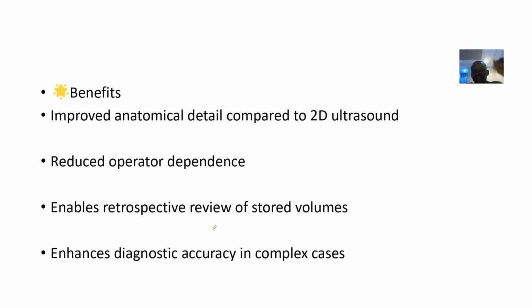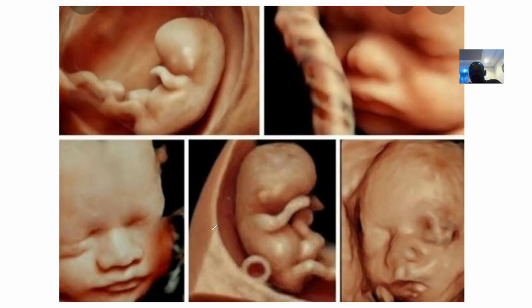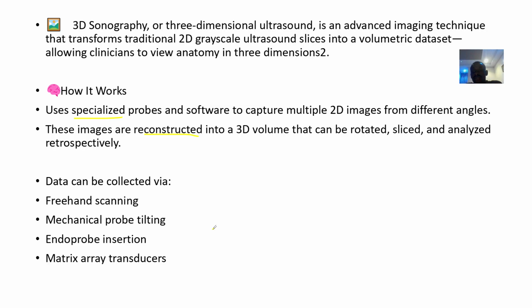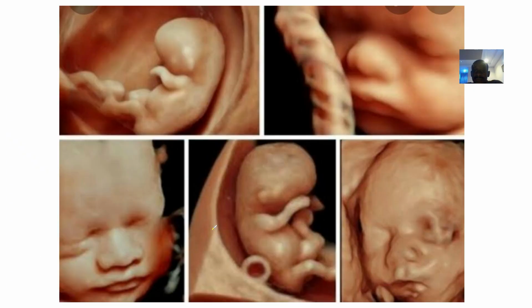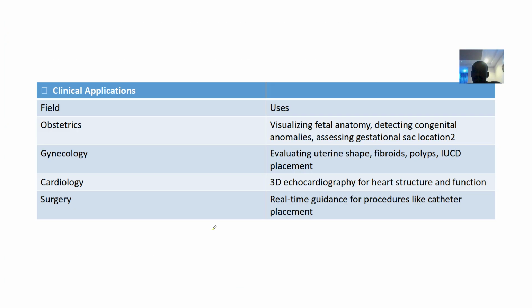It enables retrospective review of stored volumes and enhances diagnostic accuracy. It can help you make the right decisions. If this baby has a problem with their head, it's very obvious. So that's it for 3D sonography, or the three-dimensional ultrasound.